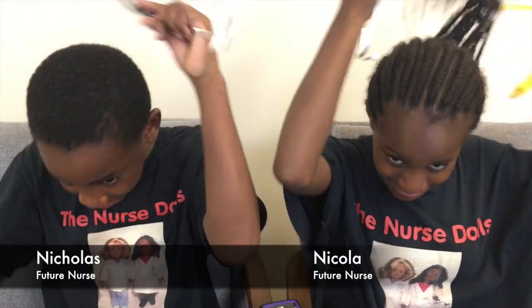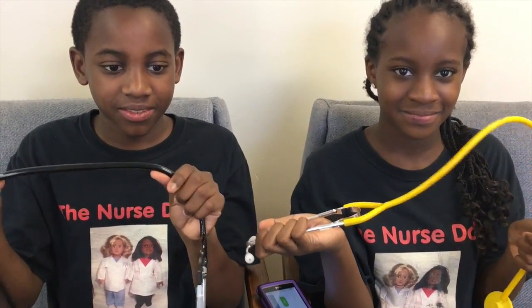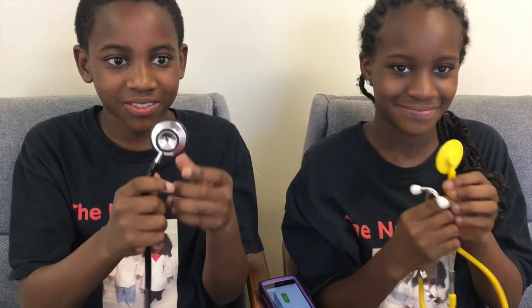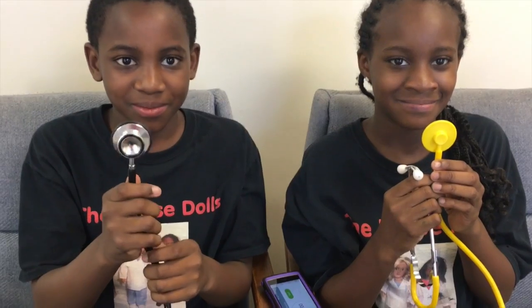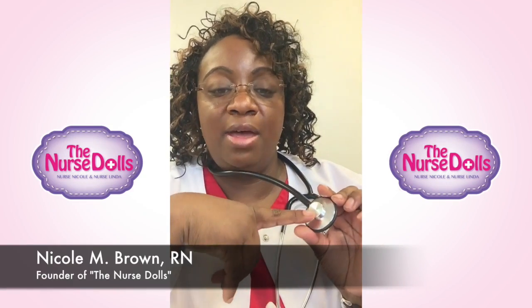Which part is the earpiece? All right, great. And then how about the tubing of the stethoscope? All right, great. And how about the bell? Yes — that would be the one that Nicholas has. Nicola does not have a bell on her stethoscope but she was showing where the bell would be. And the diaphragm — all right.